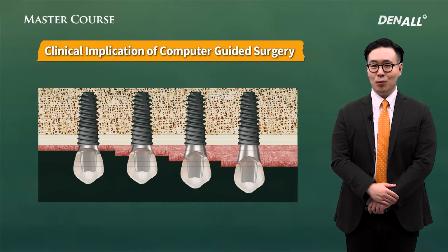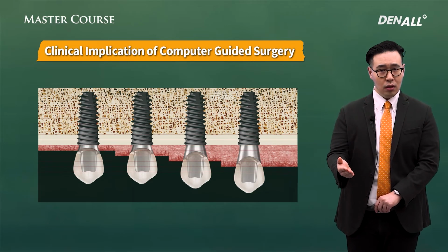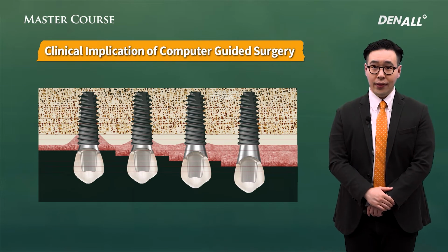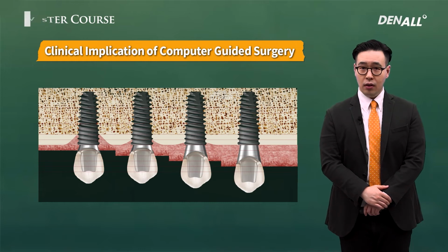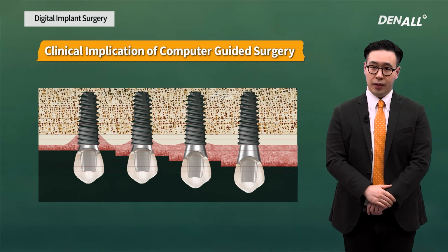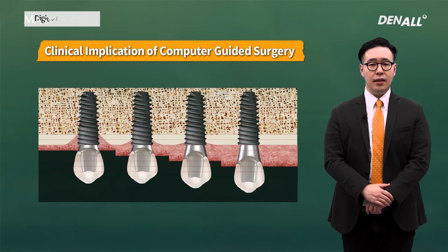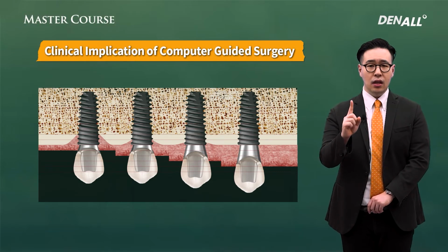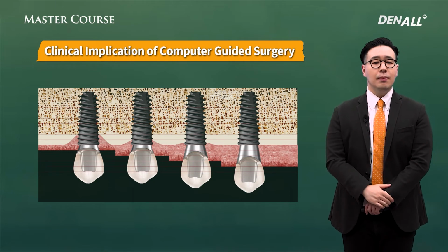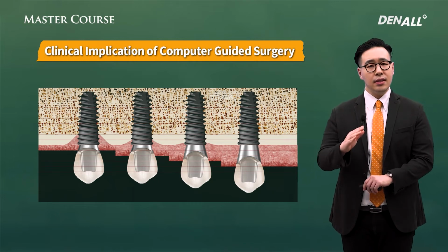So, if the thin soft tissue is not properly identified and the implant is placed aligned with the bone surface, as soon as the healing abutment or temporary prosthesis is connected, biologic width kicks in, causing bone resorption. This should be remembered. The first rule is to place 1 millimeter deeper than the bone surface. The second rule is to calculate the soft tissue thickness. Clinically, when busy, this is frequently overlooked. That's the big difference.